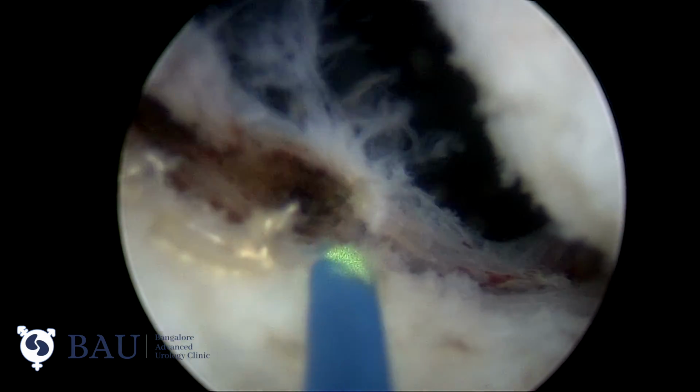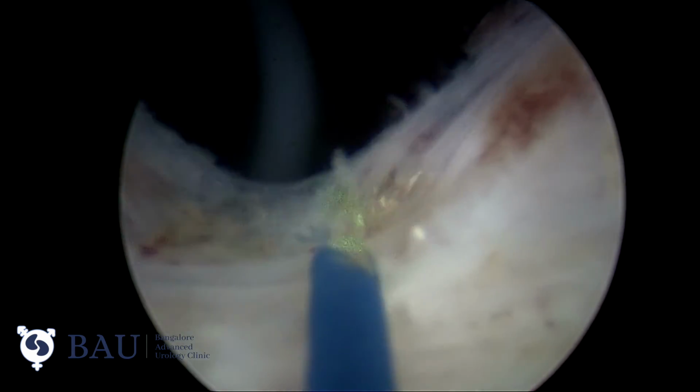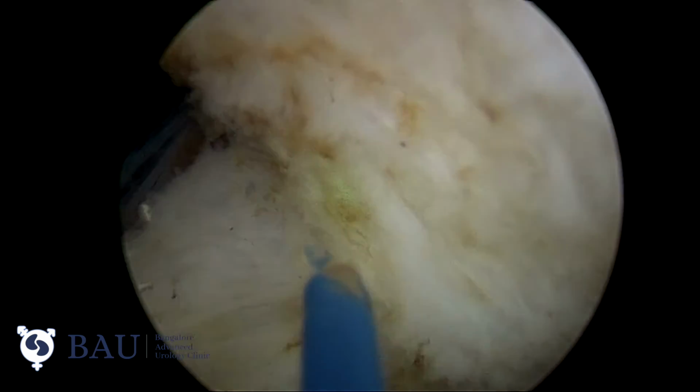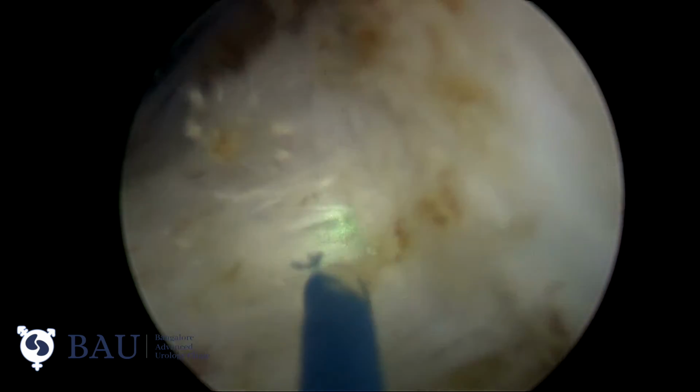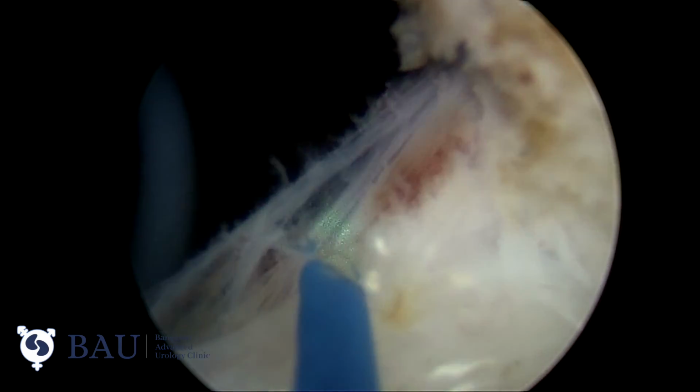These are the mucosal bleeders which create a lot of problems during morcellation if you don't tackle them properly. Here the biggest advantage for me is prior stenting, that I'm sure that I am far away from the ureteric orifice by seeing the stents.